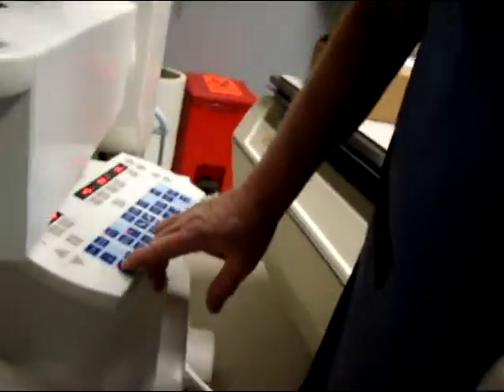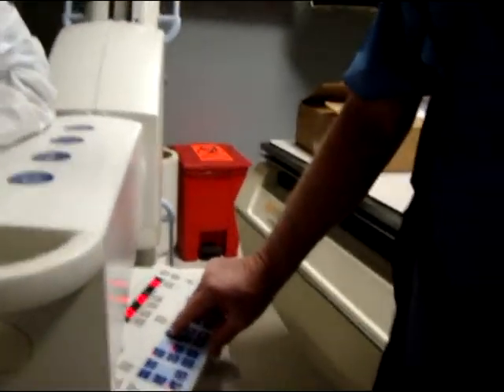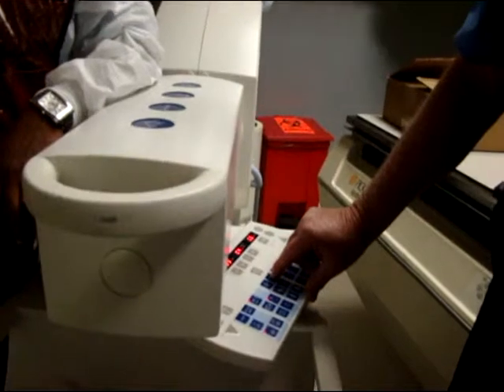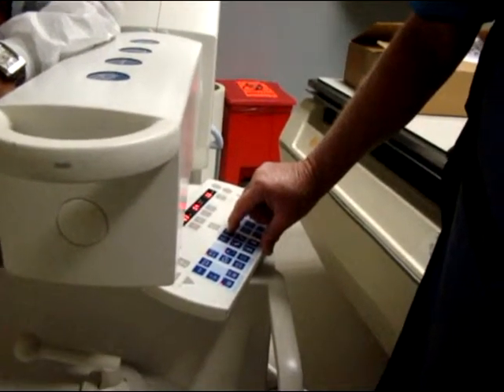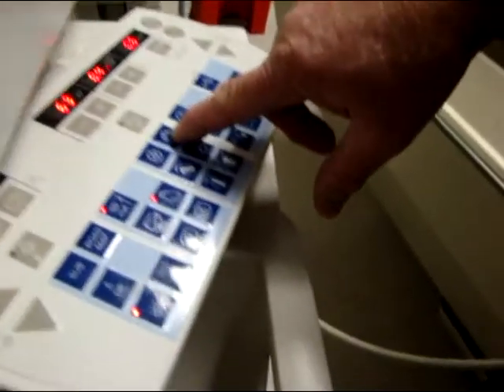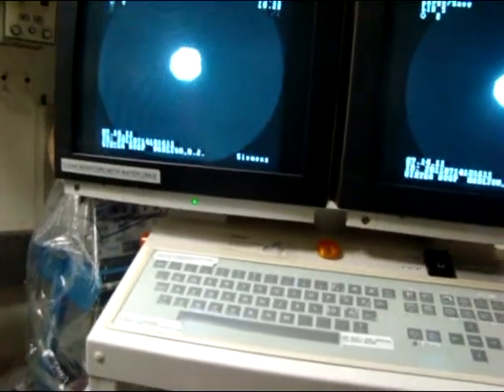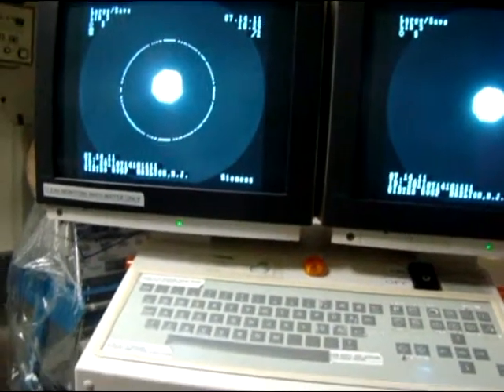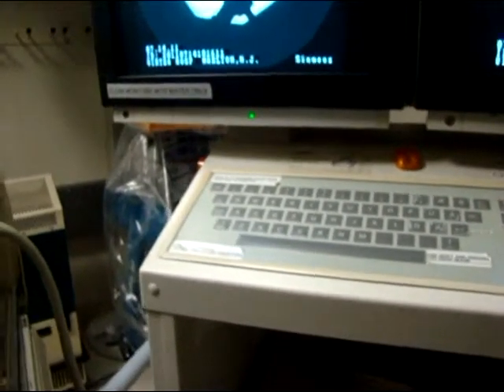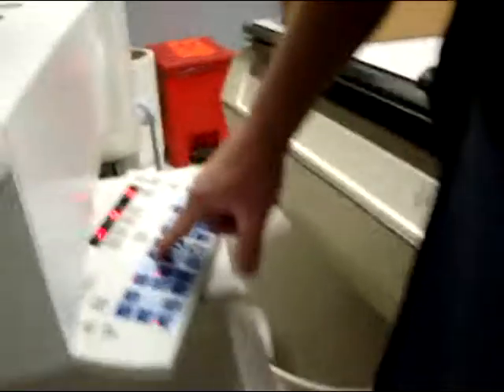Could you show me the different modes? Let's say you want a nine inch. How many fields are in here? You have to cone yourself — you cannot pick here. This is your cone. That's your smallest; we're using like a four and a half right now. You could use anywhere from four and a half to eleven — there's no predetermined size. You can go eight, nine, seven — it's a scale.